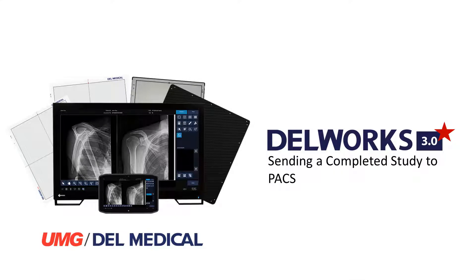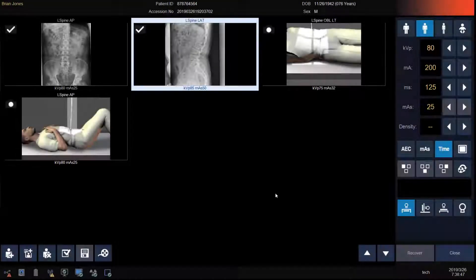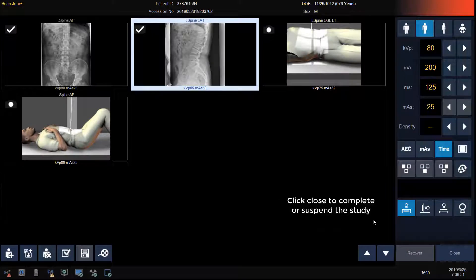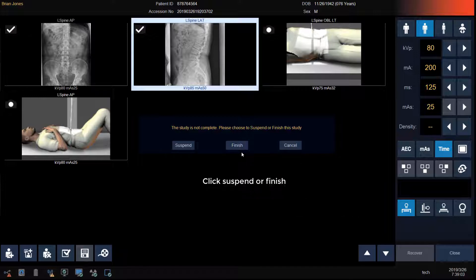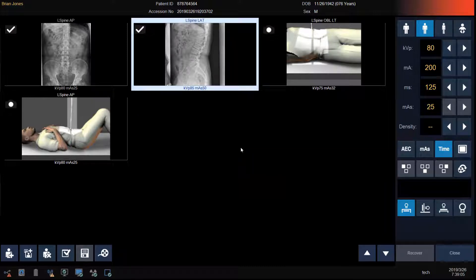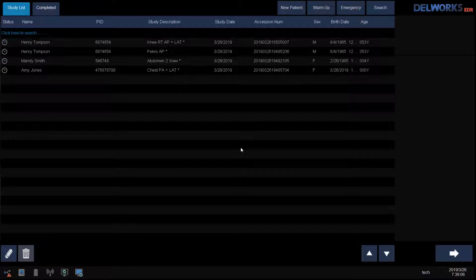Now we will review completing your study and sending your images to PACS. Once you've completed all of the views for your study, click the Close button to send the images to PACS or to suspend the study and finish it later. Select Suspend to not send the images to PACS and finish later, or Finish to complete the study and send the images to PACS. We are now back at our study list ready to do our next patient.